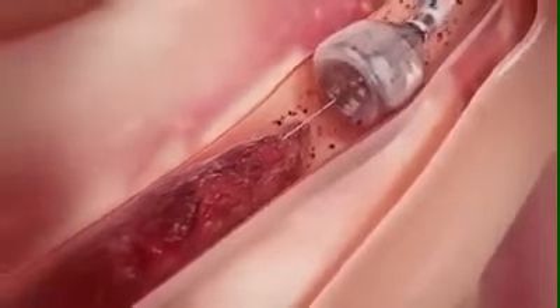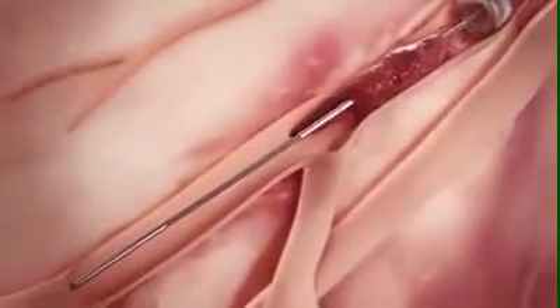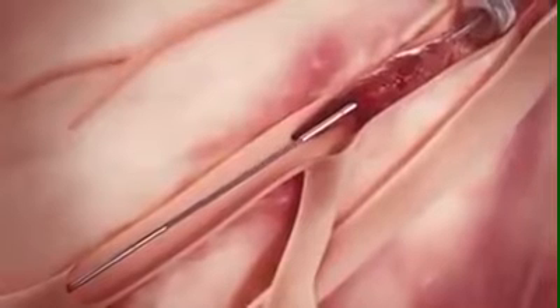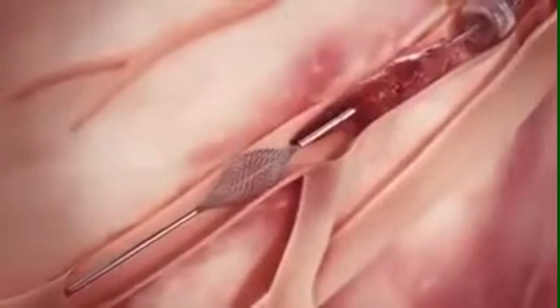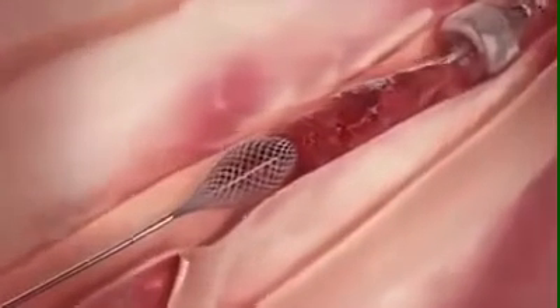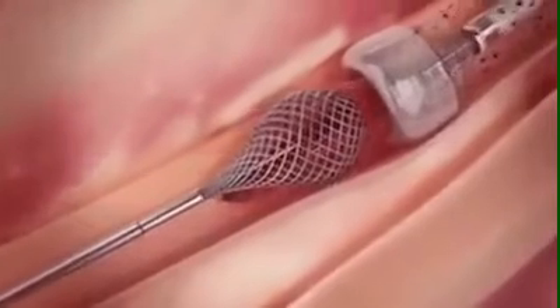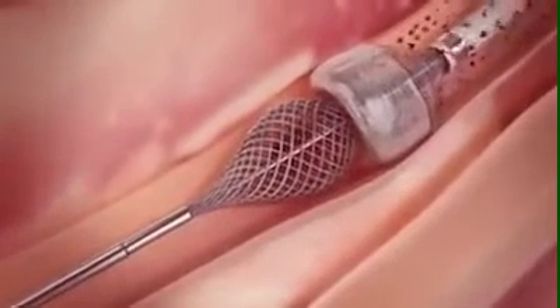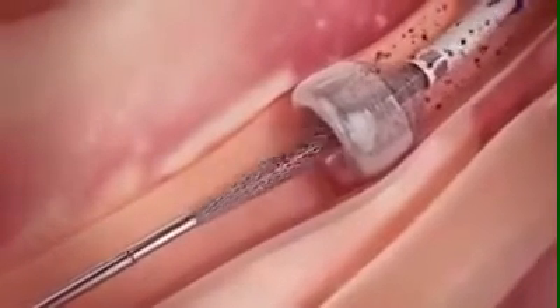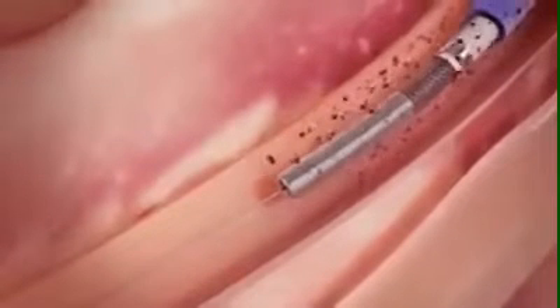Once the Megavac arrests blood flow, the thrombo wire is inserted through the catheter, advanced through the clot, and deployed distal to the clot. While applying suction with the Megavac, the thrombo wire is retracted to simultaneously pull the clot into the funnel mouth and through the catheter. After complete clot removal, suction is discontinued and the catheter tip is undeployed, restoring distal blood flow.